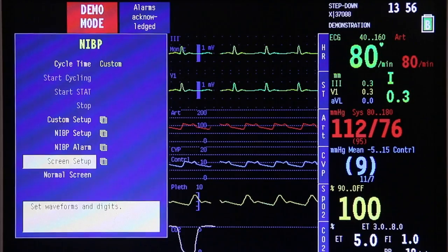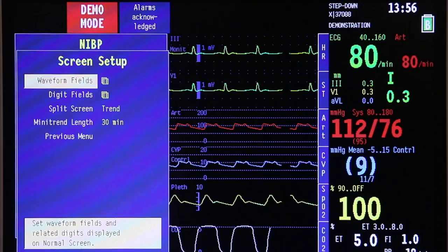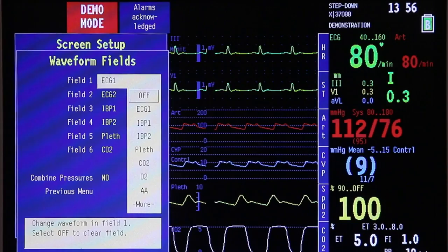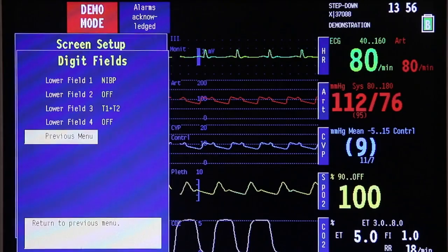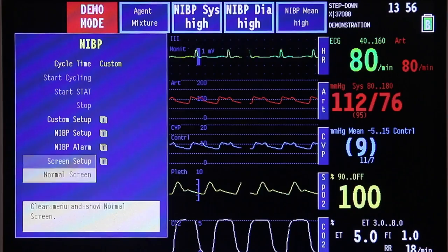Next, screen setup — where you will set the NIBP position, whether you want it on the upper parameter field or on the lower parameter field. Once done, go back to the previous menu and then go back to your home screen.